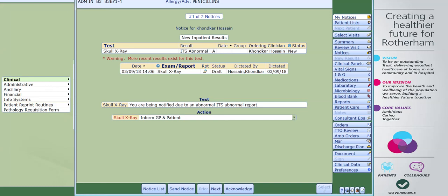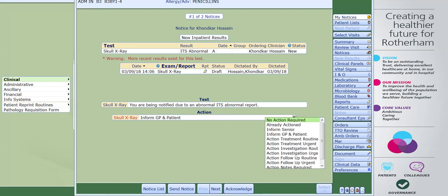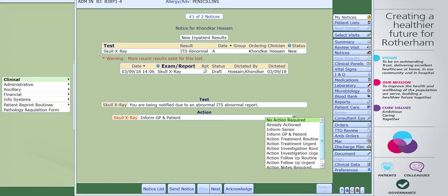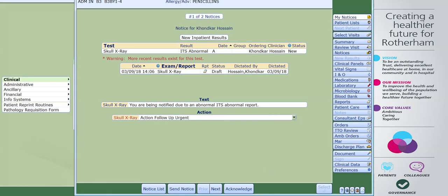On the acknowledge report screen you are now required to record your intended action. Please bear in mind that this functionality merely logs an intention to carry out an action — it does not do the action on your behalf. Click onto the action drop-down list or press F9 on your keyboard to see the list of actions available. Using your scroll bar or up and down cursor keys will take you through them. Select what action you require and remember this does not do the action for you; it merely marks on the system that this is the intended action you wish to follow. Once you have selected your action, click onto the acknowledge button.